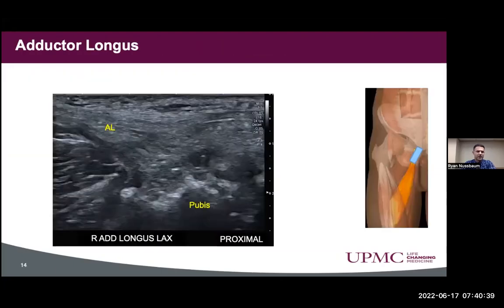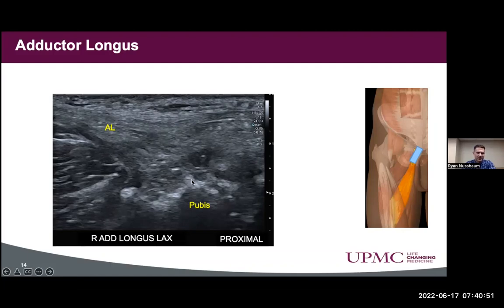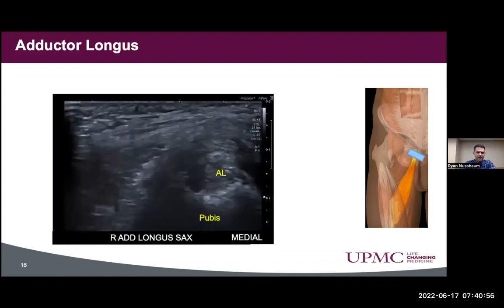Next, we looked at the adductor longus. There is certainly an enlargement of the adductor longus tendon as it becomes more proximal, with a heterogeneous appearance. The pubis also showed considerable cortical irregularity. Looking in short axis, there's also cortical irregularity and some heterogeneous appearance of that tendon.